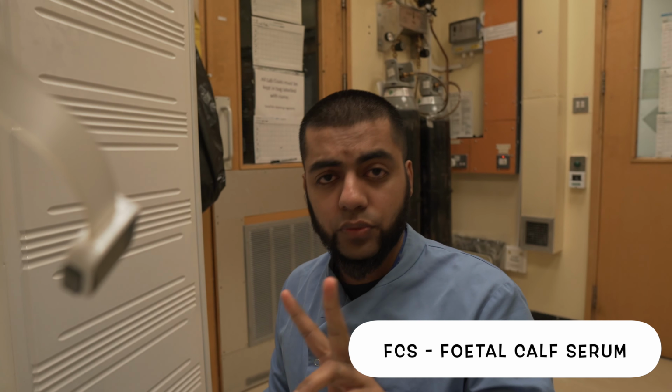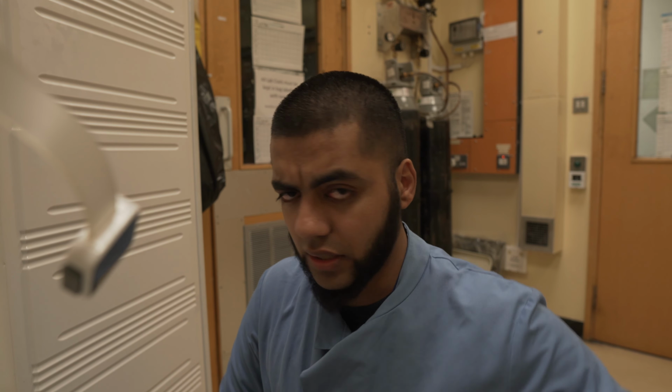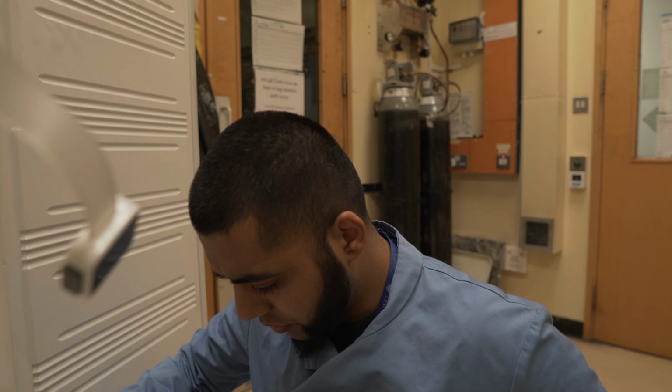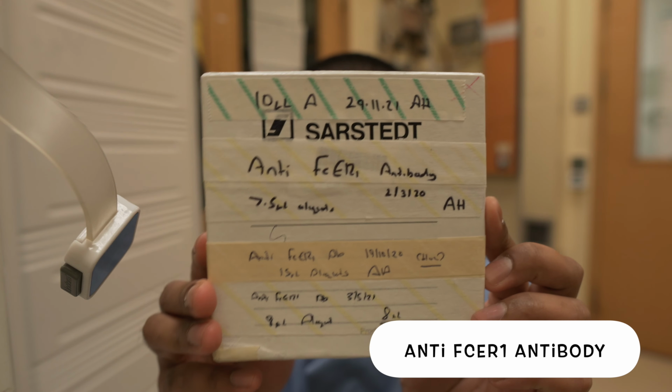I have two versions. I have iron supplemented and non-iron supplemented. So for HMC, so for human mast cells, the cell line, we use iron supplemented, and for various other cell cultures, say airway smooth muscle cells, other forms of cells, we use just a generic fetal calf serum.